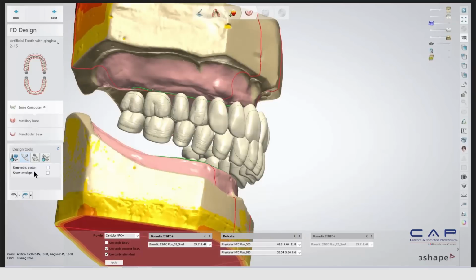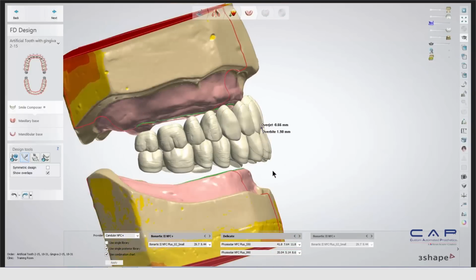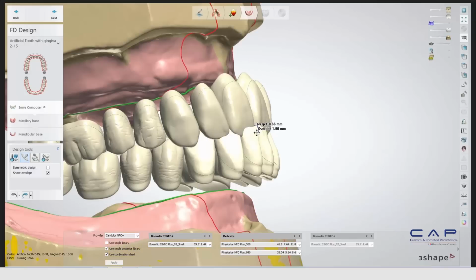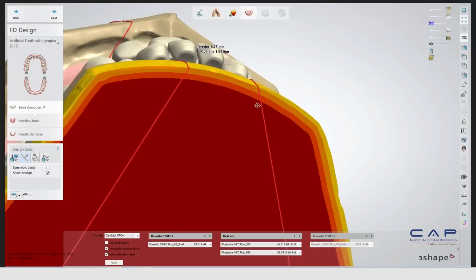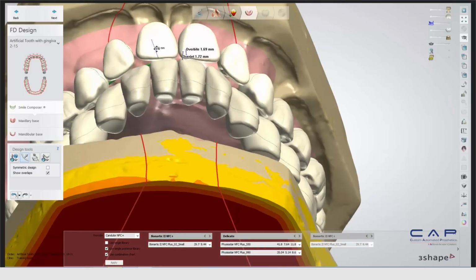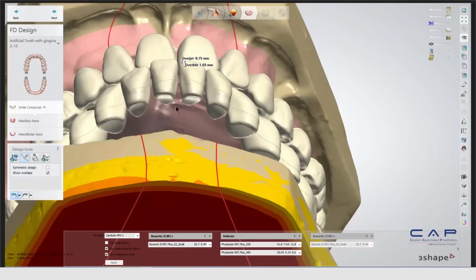Here you can have symmetric design or show your overlaps, which are areas where your denture teeth overlap. So you can go ahead and prevent that from happening. Like over here, you can see the overlap is happening. So we're going to go ahead and sort of pull these areas out or up to kind of help shape these areas. If we make a change and we don't like it, we can always undo, just like the other ones.